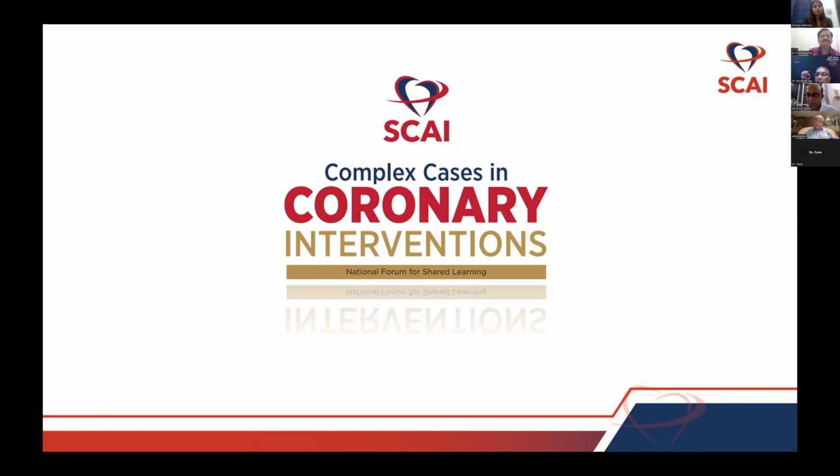This is the luck where luck smiled on the operator, because if that Fielder XT had failed, it would have been a Pandora's box, because you could not penetrate that with a very stiff wire.